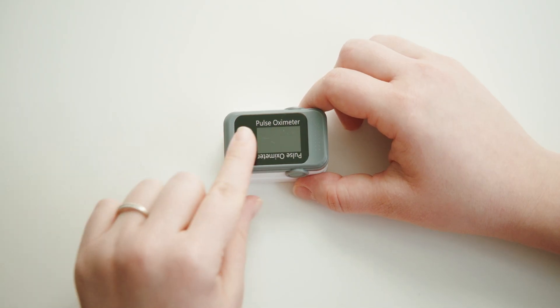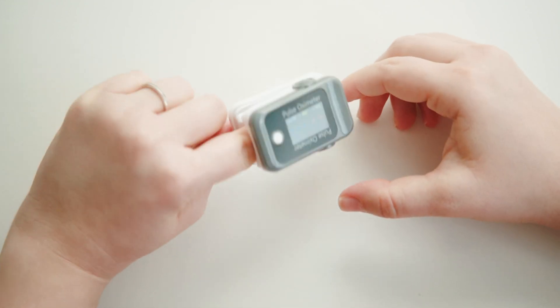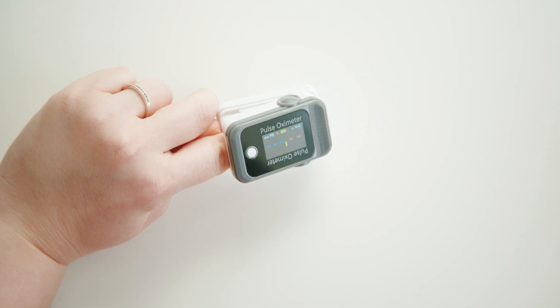In order to take a reading, press the small white button on the device to power it on. Then open the device, insert your index finger, and close. After a few seconds, the pulse oximeter will begin to take your reading.